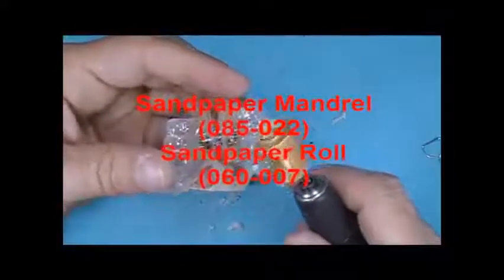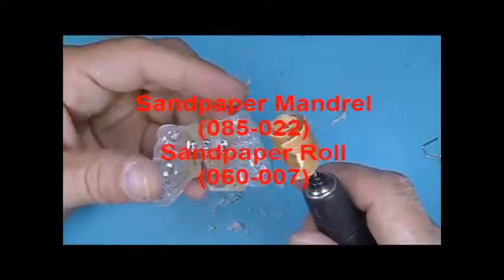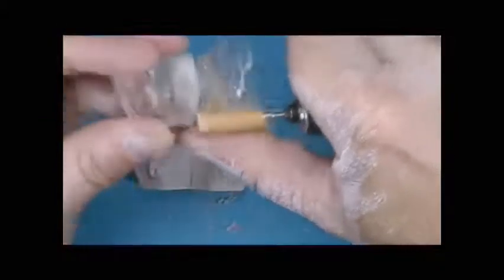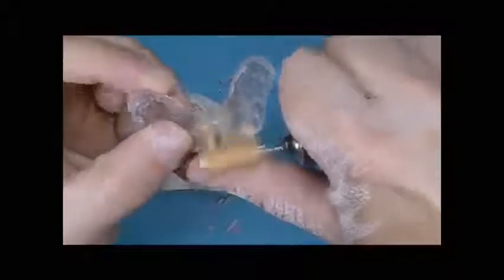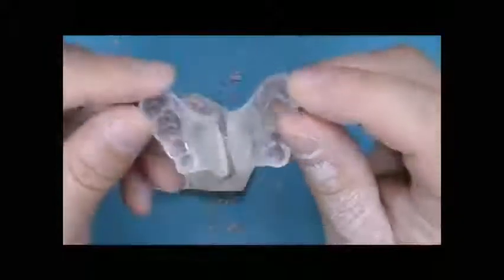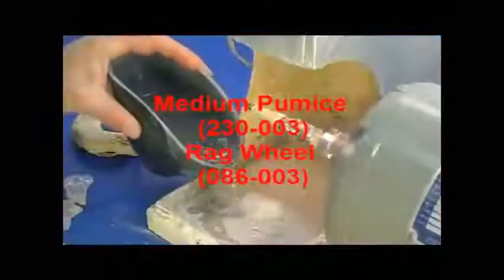All trimmed acrylic surfaces will be smoothed using a sandpaper mandrel. A 3 to 4 inch strip of 150 grit sandpaper is removed from its roll and slid into the center slot of the mandrel. Use light pressure against acrylic when trimming these surfaces. The appliance is ready for the finishing process.